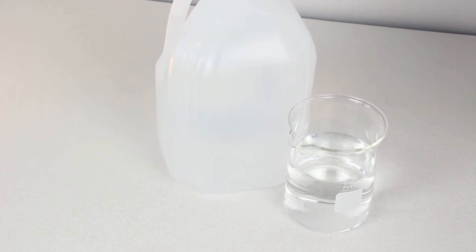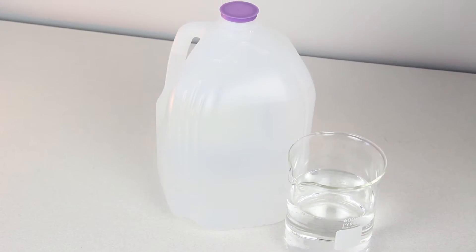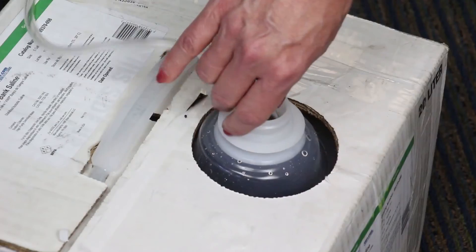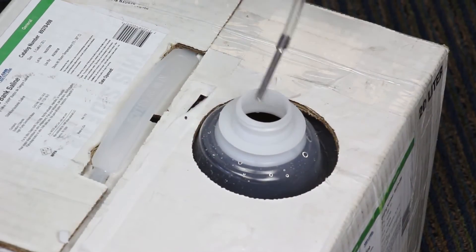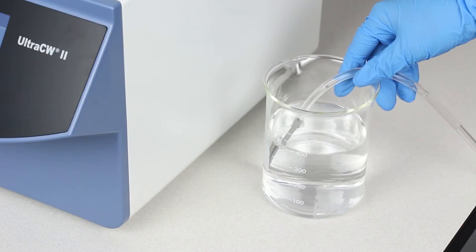Prepare a container with 400 milliliters of 10% bleach solution and a container of deionized or distilled water. Disconnect the saline tube from the saline container and place it into the container with the bleach cleaning solution.